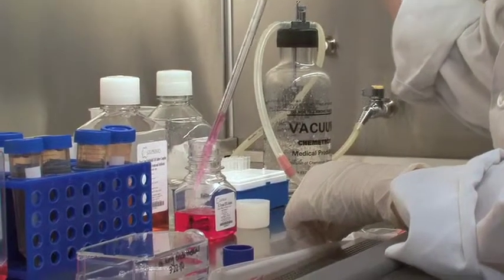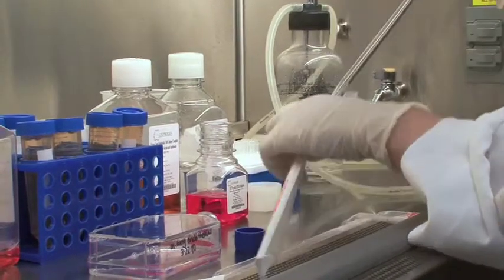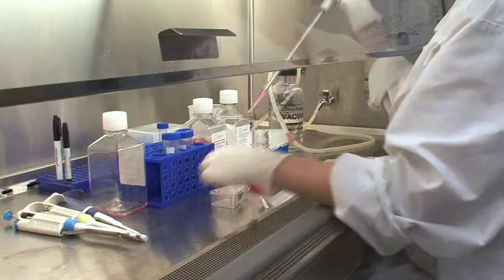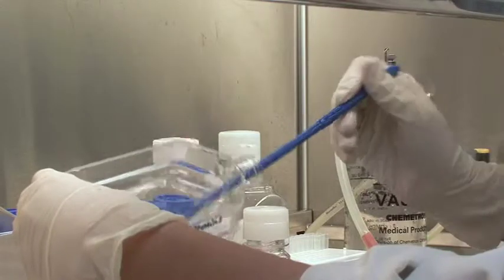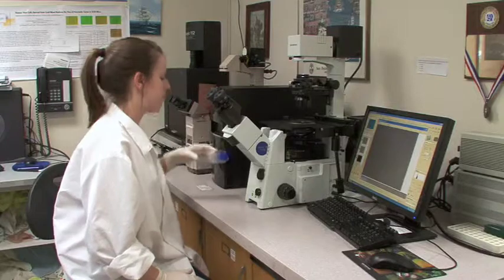Trypsinize the remaining cells with 3 milliliters of trypsin EDTA. That's from the Celprogen catalog number T1509-014. Note, in the T25 version of the protocol, use 2 milliliters of trypsin. Prior to observation, gently tap flasks to dislodge adhered cells.